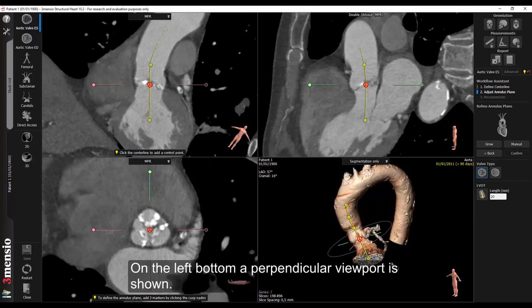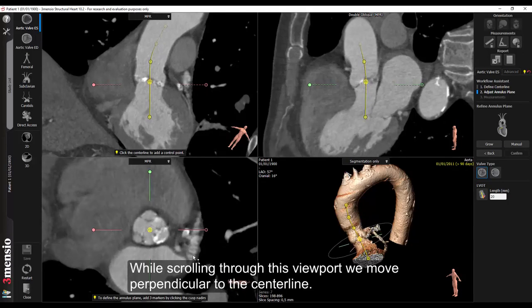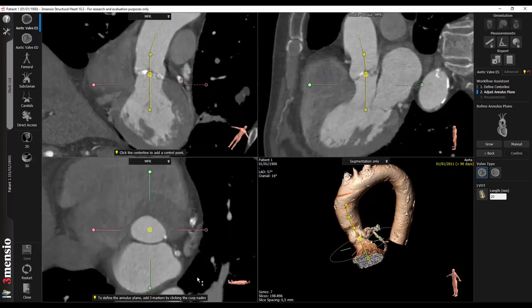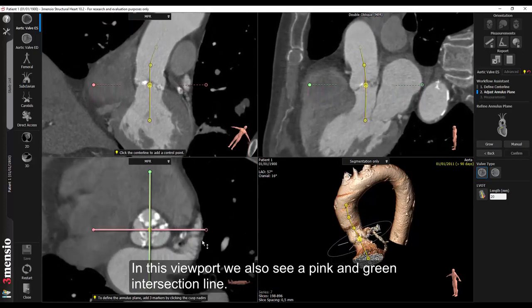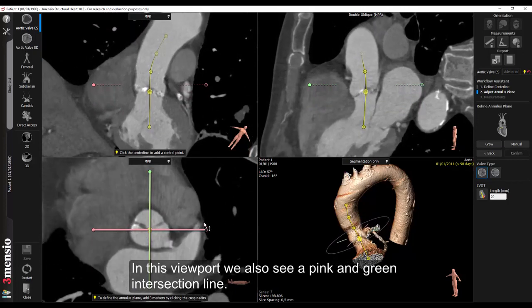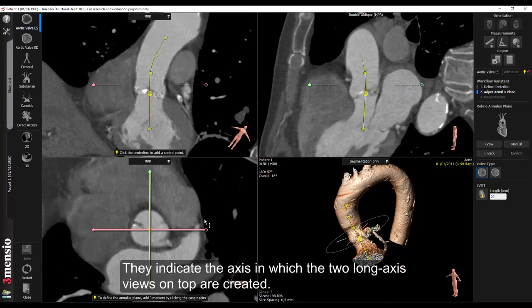On the left bottom, a perpendicular viewport is shown. While scrolling through this viewport we move perpendicular to the centerline. In this viewport, we also see a pink and green intersection line. They indicate the axis in which the two long axis views on top are created.